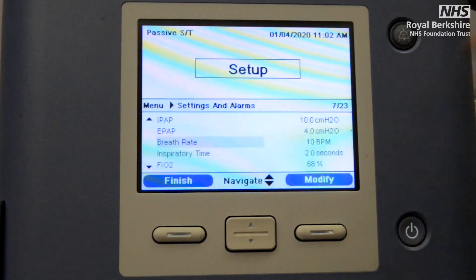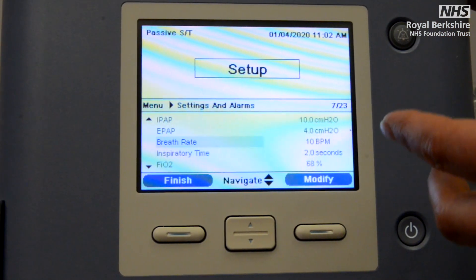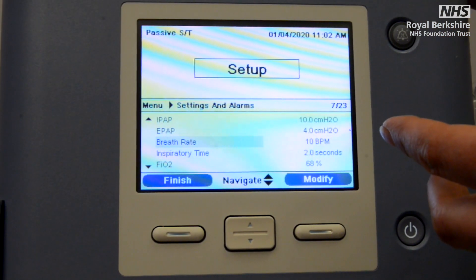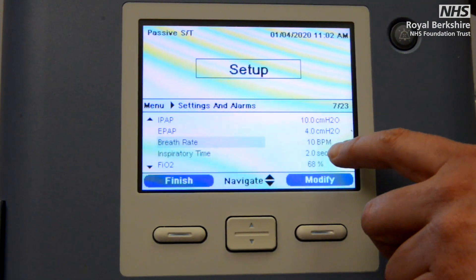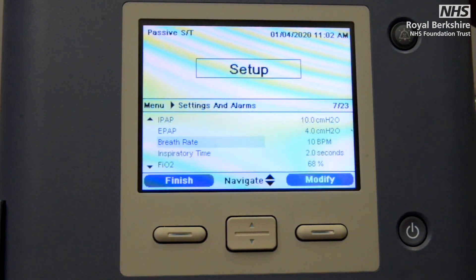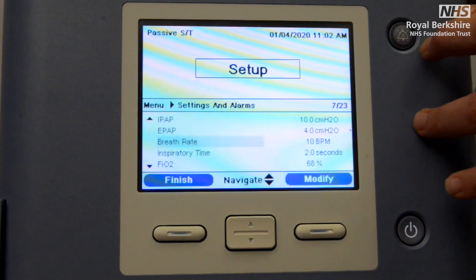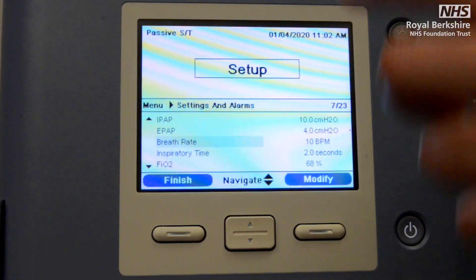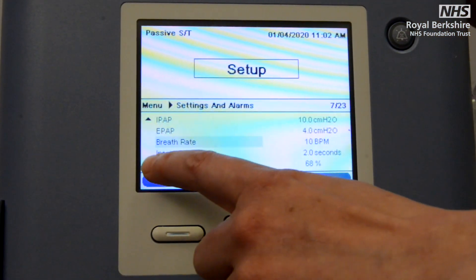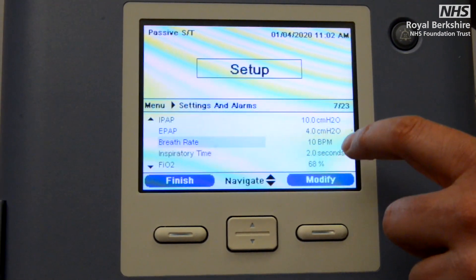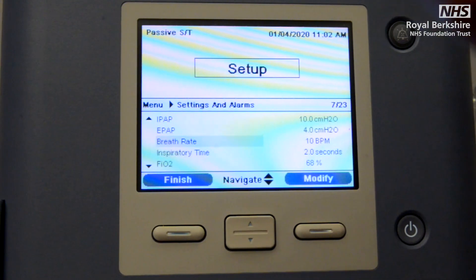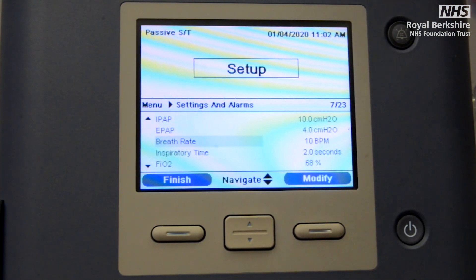Ten breaths per minute is the minimum we would like the patient to have mandated should they not be spontaneously breathing at all. If the patient is maybe taking four breaths per minute, the machine will still recognize that and will also offer some mandated breaths up to a total of 10 breaths per minute — so it will work out how many spontaneous breaths the patient is taking as well.